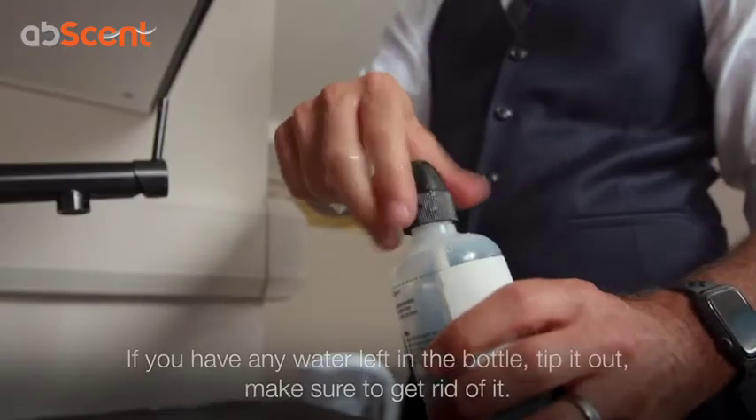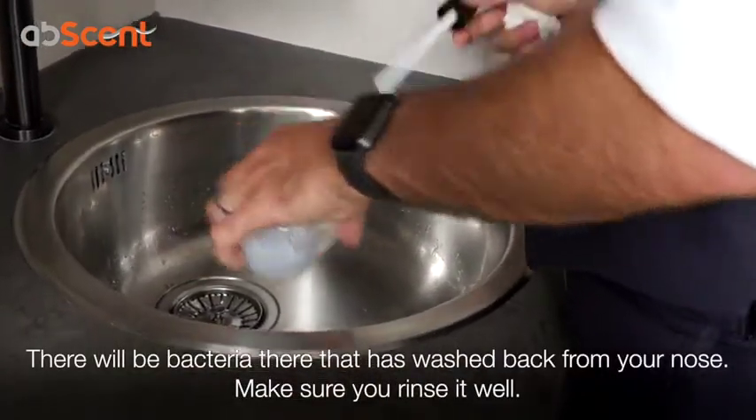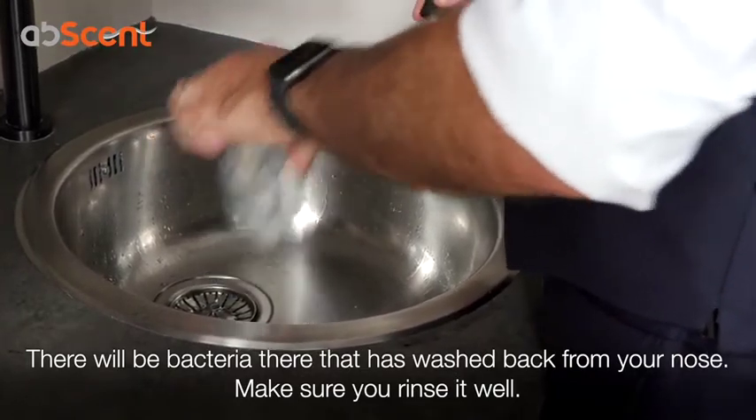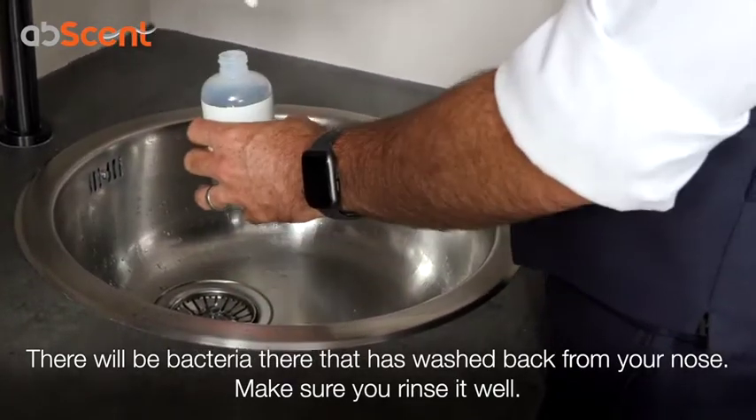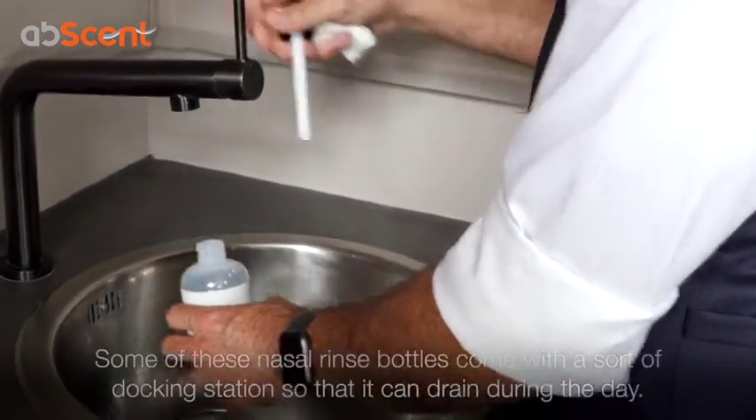If you have any water left in the bottle, tip it out. Get rid of it, because there are bacteria in there now due to backsplash from your nose. So make sure that you rinse it out and give it a good rinse.